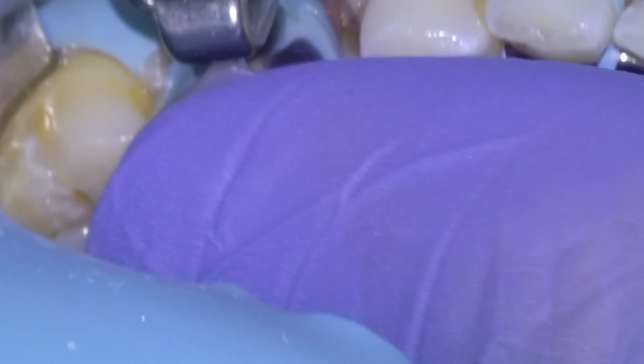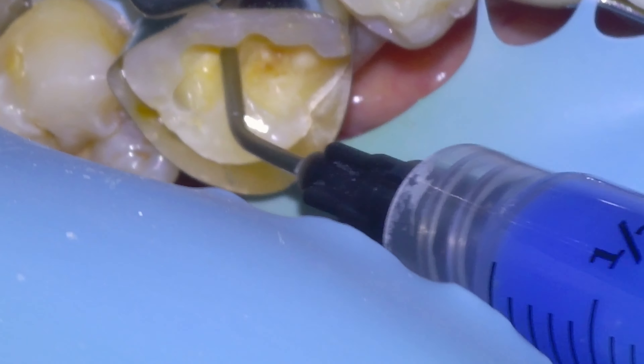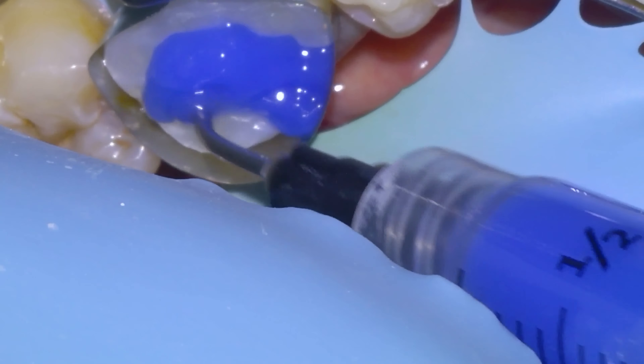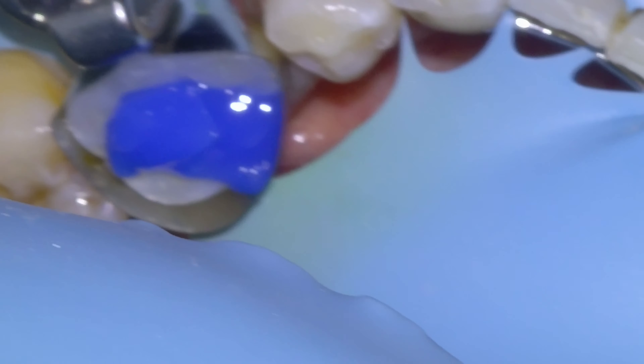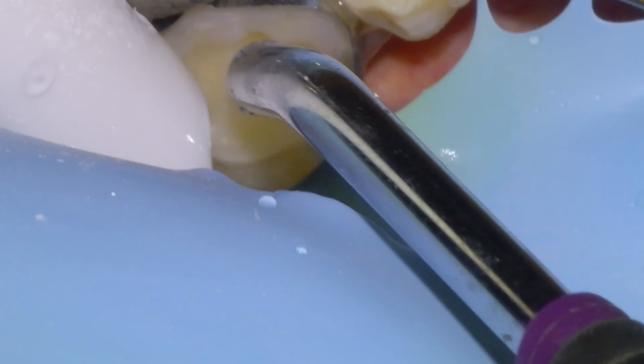We're going to slide it down as far as it will go and then cinch it up as tight as we can. Now we're ready to fill, so we're going to condition the surface of the tooth for bonding — applying our Sweet Baby Ray's acid etch for about five seconds before rinsing it off thoroughly. That's just a conditioner that cleans the surface of the tooth so that the filling bonds tighter.